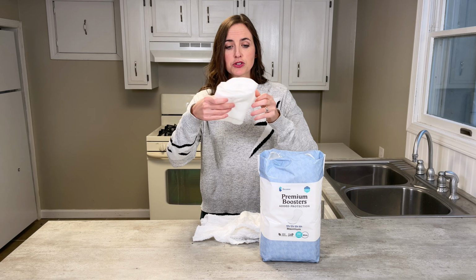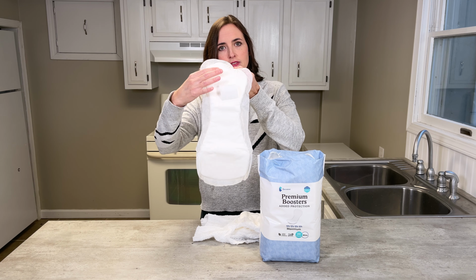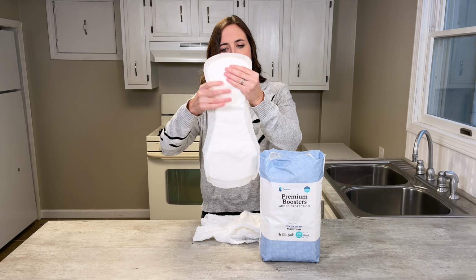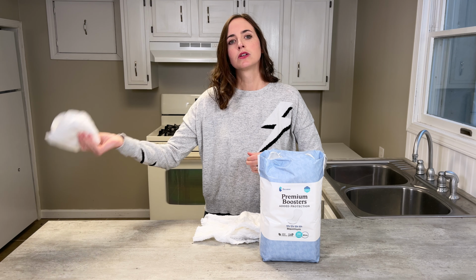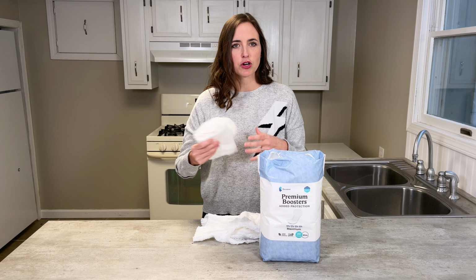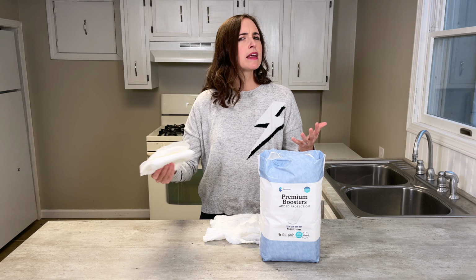Simply remove the booster. It's got a simple single strip that covers the sticky portion that goes down into the brief. This pulls off very, very easily. It sticks down into it just like with underwear, and then it can be tossed when it is soiled and a new one put in its place. Much easier, much more likely to be independent with versus having to change out a full brief multiple times a day. Who would not be appropriate for this?